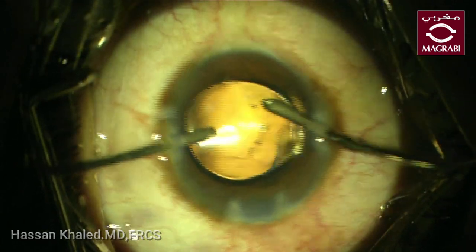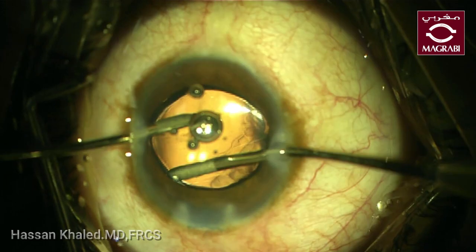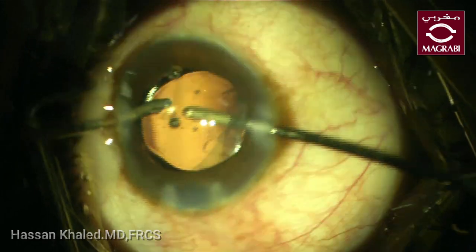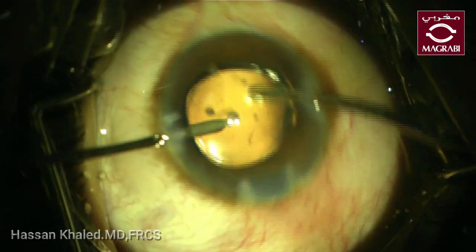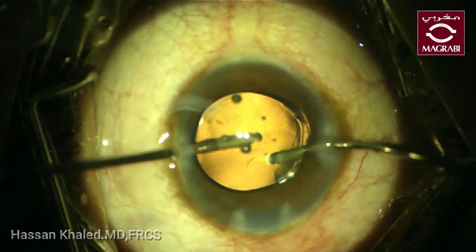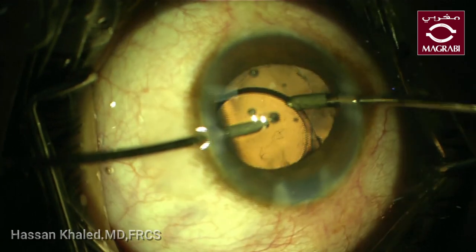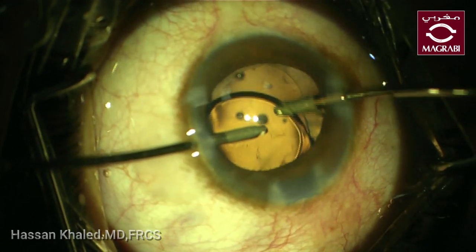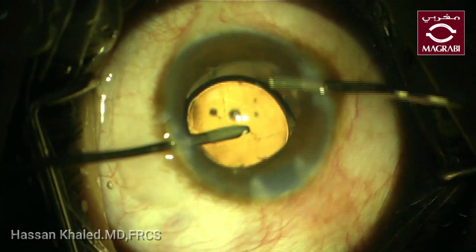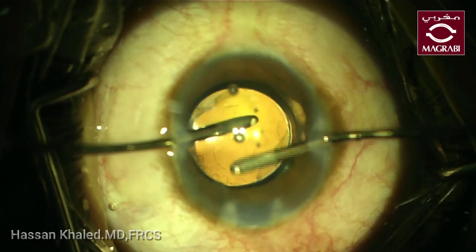Also, behind the IOL you can still see the fluttering anterior capsular flap at the side of the extension — the flap is fluttering and inverted into the anterior chamber towards the iris.